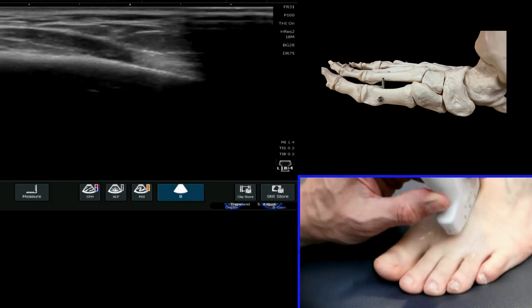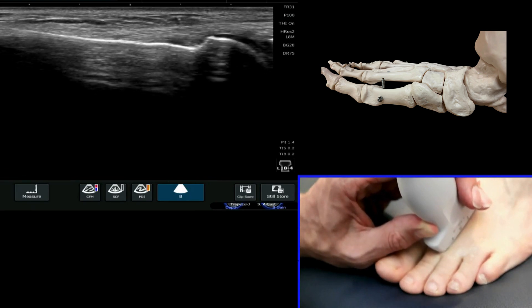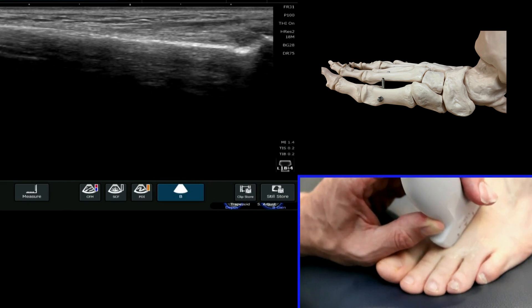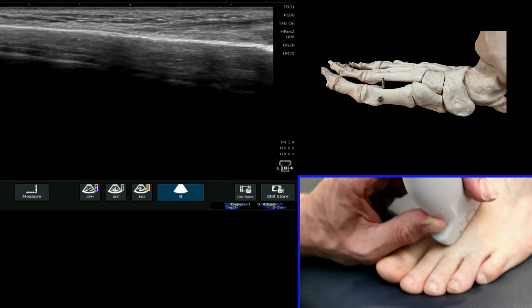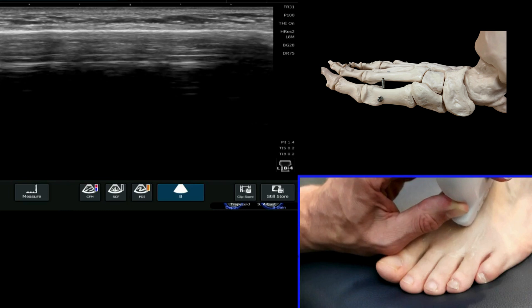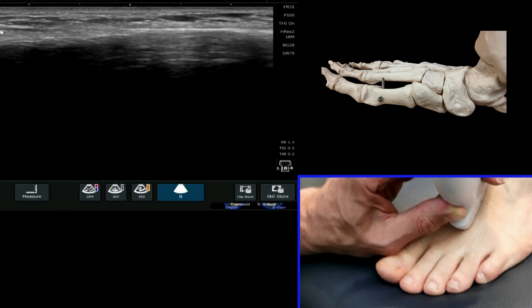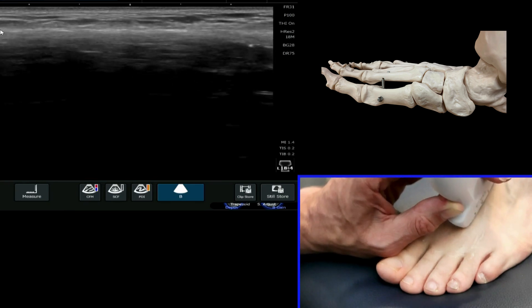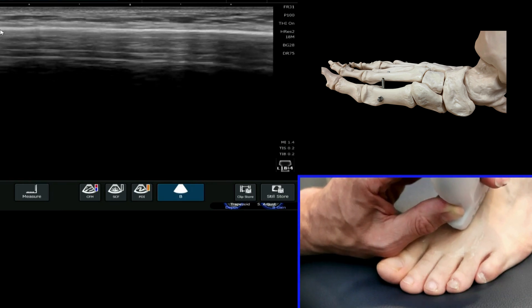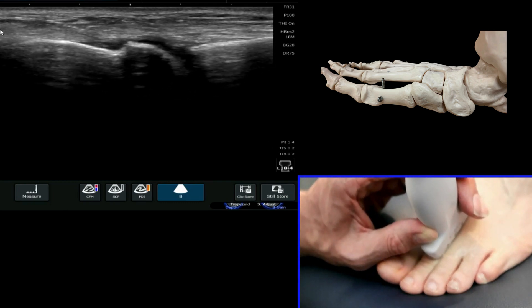You can then also have a look in long axis as well. If you see something in short axis, it's very important to verify in long axis — one view is a view too few, as we often say. Looking in long axis, you can see that metatarsal shaft very clearly all the way up. Just make sure that you're totally on the metatarsal shaft and not oblique to it, as you can create what looks like a fracture by being slightly oblique. Make sure you're totally parallel to that structure, with the reverberation artifact deep to it. You can then follow that all the way down back into the metatarsophalangeal joint.